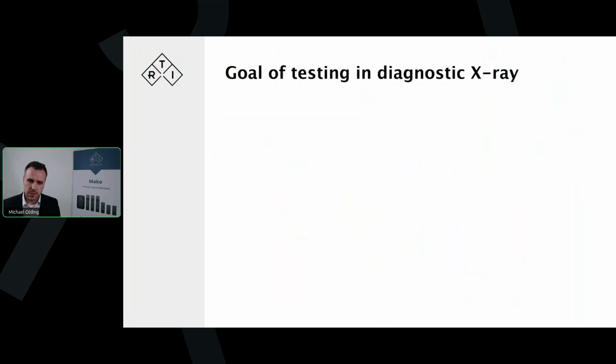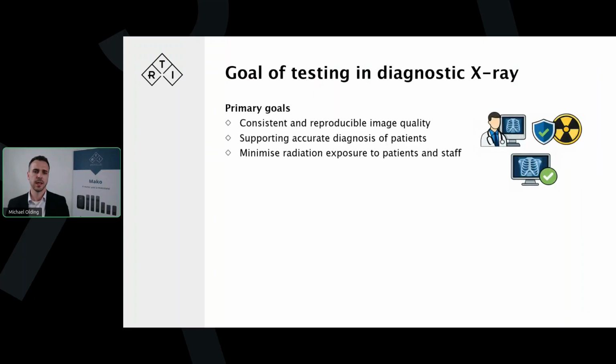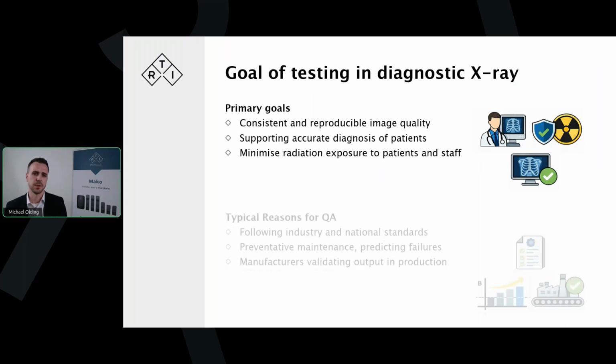So for those who are new to testing, just a short background to the goal of testing in diagnostic X-ray. And that will be for consistent and reproducible image quality. So the RTI Mako system will be used to perform the foundational measurements to support accurate diagnosis of patients, but also, of course, and importantly, minimizing radiation to both patients and staff. So ensuring that our X-ray systems are working as they should be.